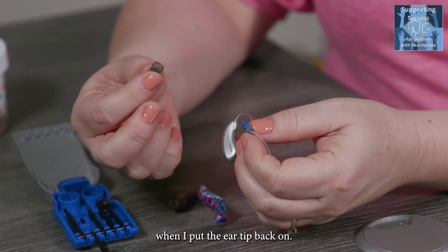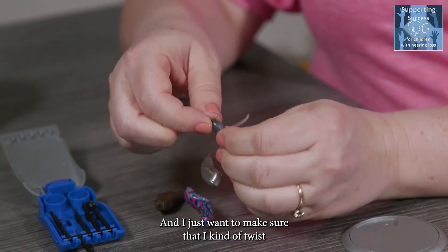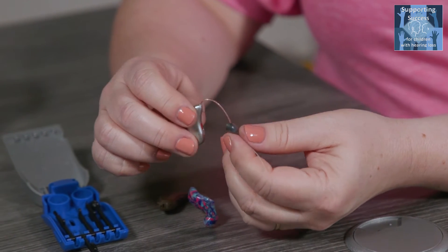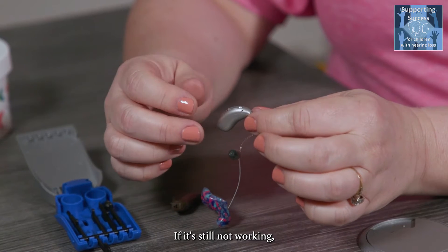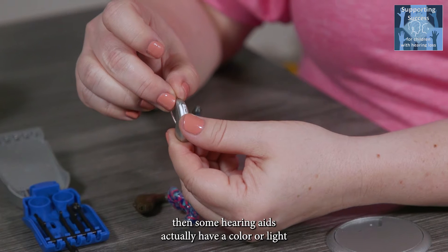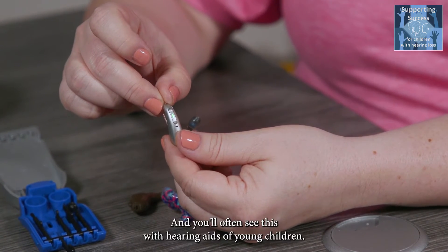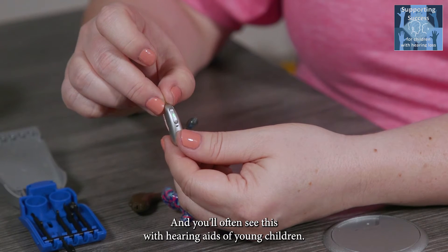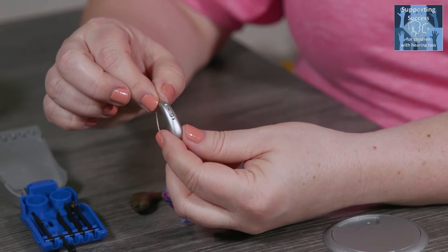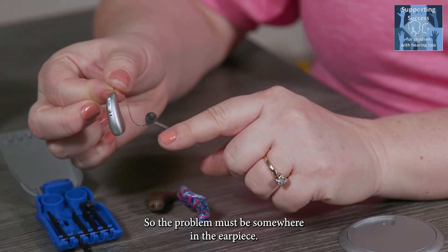When you put the ear tip back on, there's a little sleeve that it fits down into — just twist and push to get it back on there securely. If it's still not working, some hearing aids have a color or light indicator that shows if the aid is working. You'll often see this with hearing aids for young children. A flashing green light, for example, tells you the hearing aid is working, so the problem must be somewhere in the earpiece.